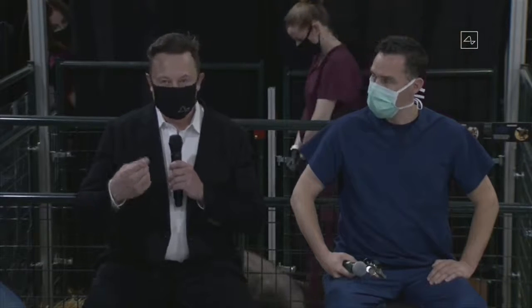Yeah, so just to elaborate on that, if somebody has a severe spinal cord injury, to the degree that they have very limited control even over their facial muscles, I think something that's very exciting as a long-term application is if you can sense what somebody's trying to do with their limbs, then you can do a second implant at the base of the spine or wherever, just after wherever the spinal injury occurred, and you can create a neural shunt. So I'm confident that long-term it will be possible to restore somebody's full body motion.